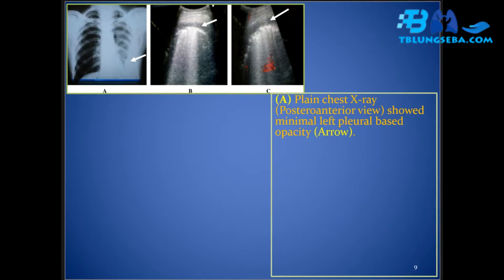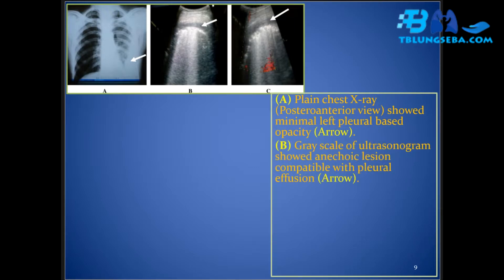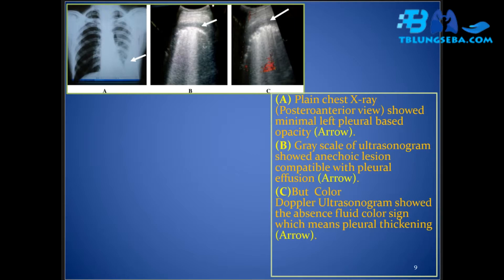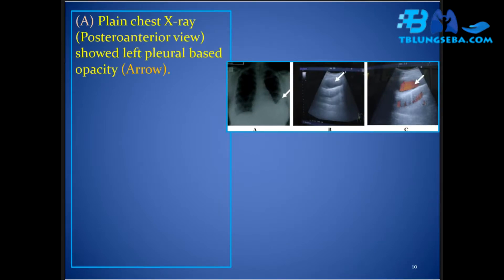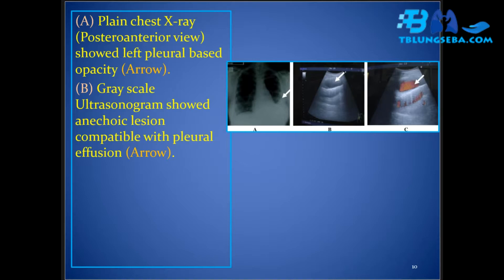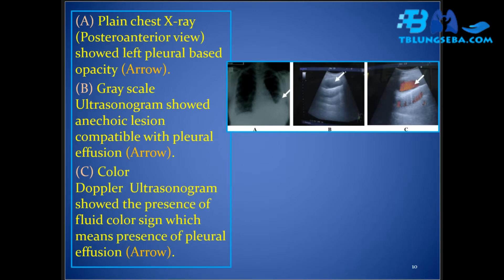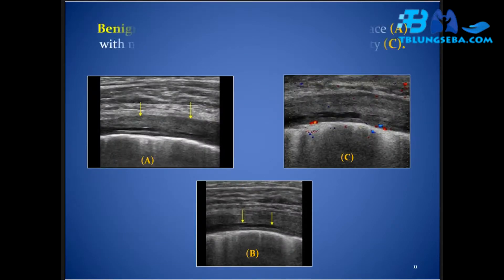A plain chest X-ray postero-anterior view showed minimal left pleural-based opacity. Grayscale ultrasonogram showed an anechoic lesion compatible with pleural effusion, but the absence of a fluid color sign on color Doppler indicates pleural thickening. In another case, plain chest X-ray showed left pleural-based opacity; grayscale USG showed an anechoic lesion compatible with pleural effusion, while color Doppler ultrasonogram showed the presence of a fluid color sign confirming pleural effusion.